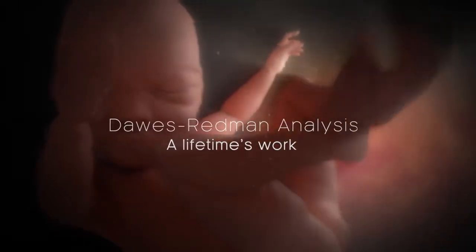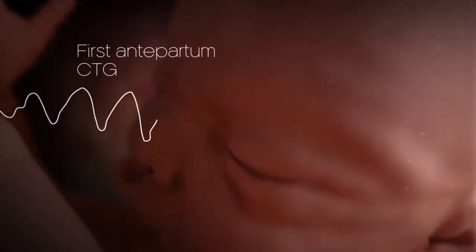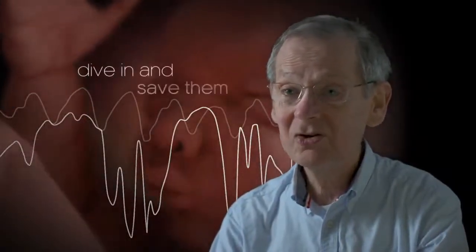I took a technique that was introduced for monitoring in labour and applied it to monitoring the baby before labour. I did the first antepartum CTG and very quickly learned that yes, you could see the dying baby, which we couldn't know about before, and you could dive in and save them.